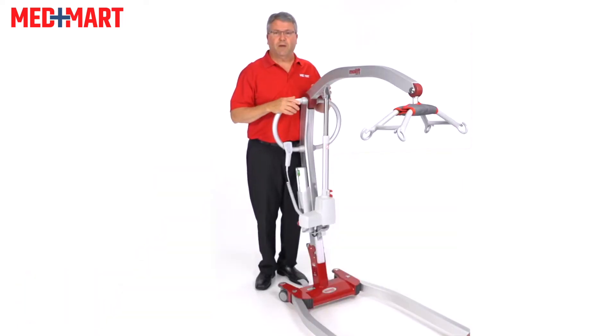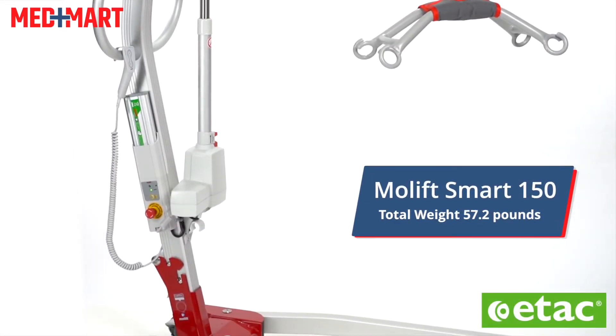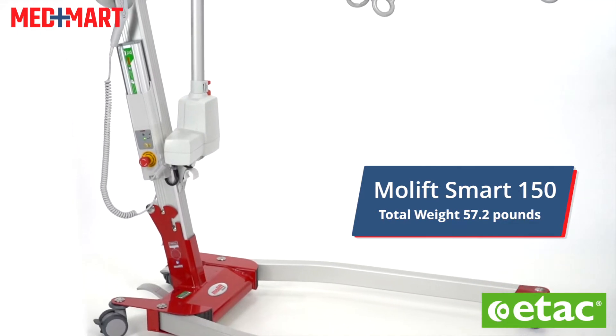My name is Jeff. I'm a customer service rep and product specialist here at MedMart. This is the Molift Smart 150 from ETAC, and we're going to go ahead and take a look at some of the features of the Smart Lift 150.